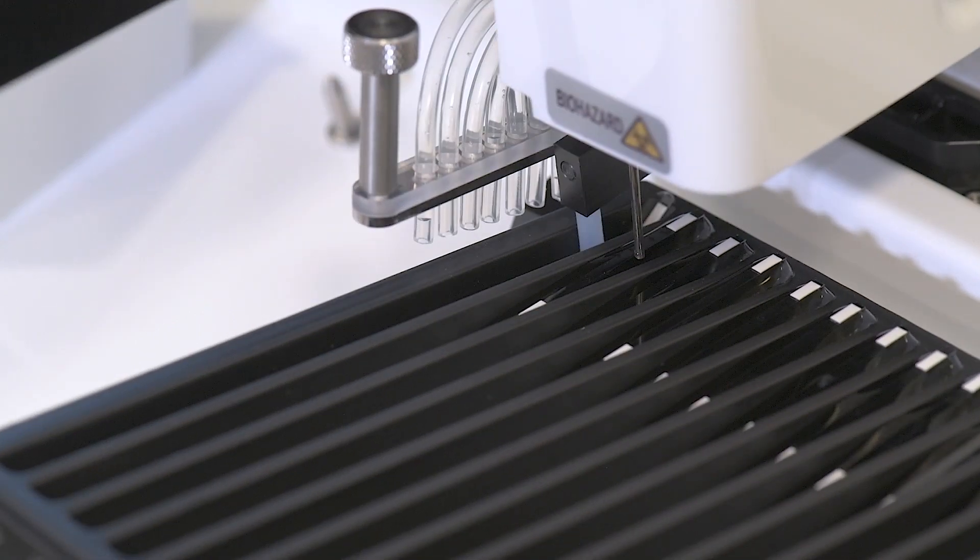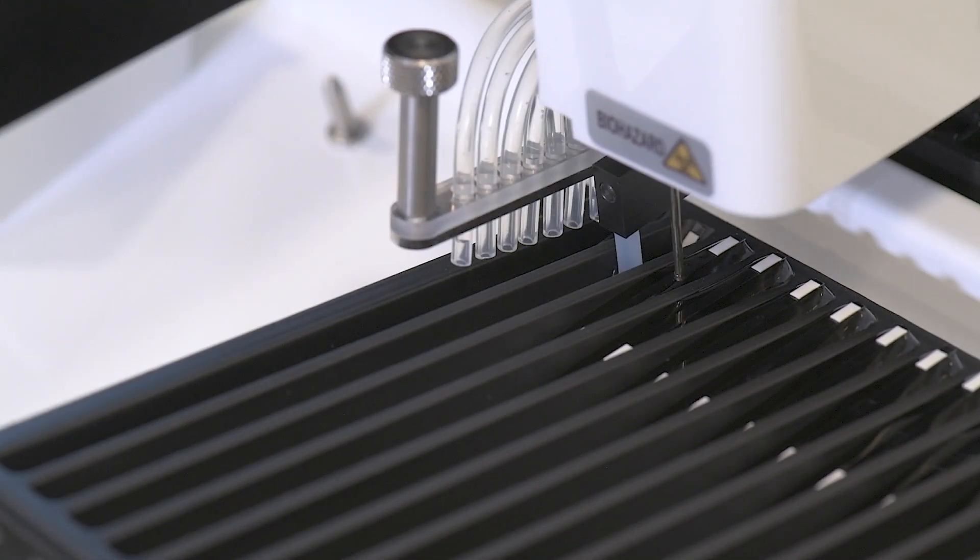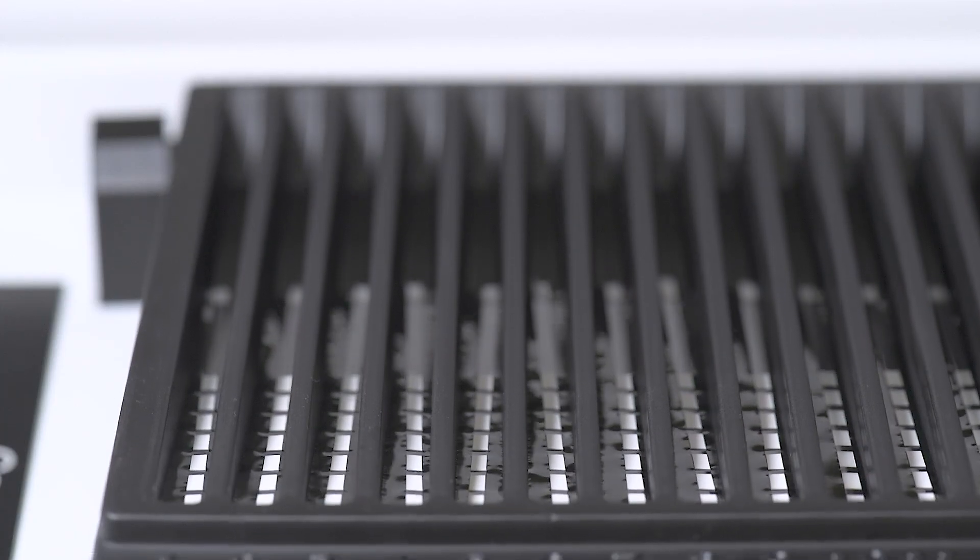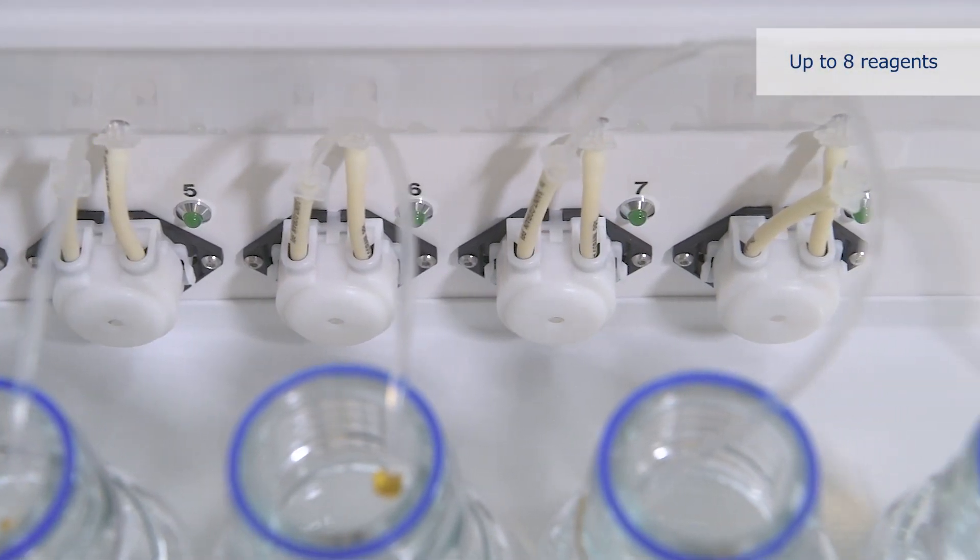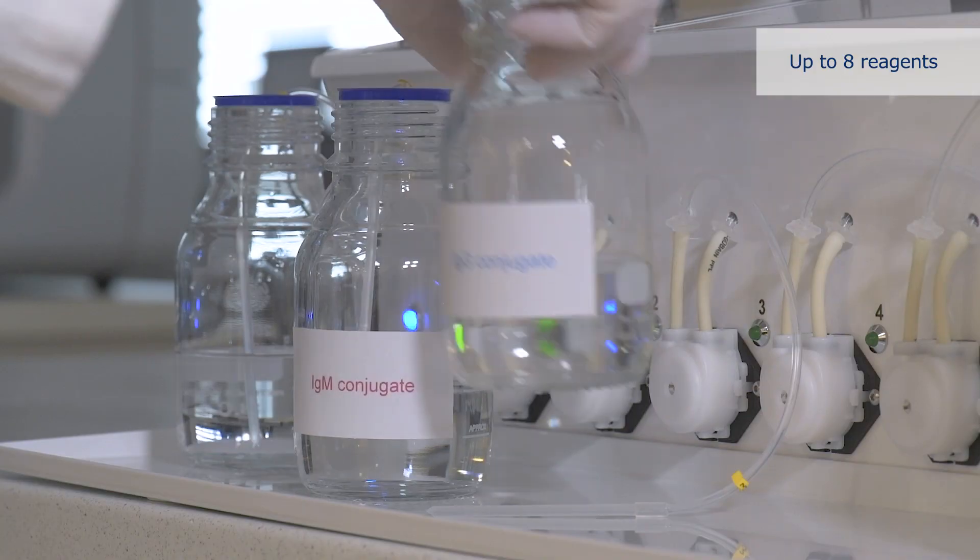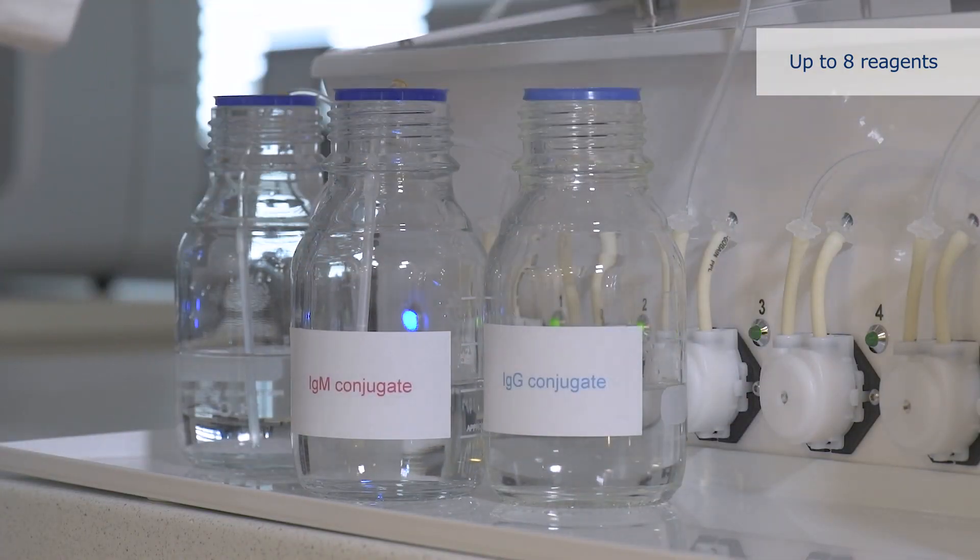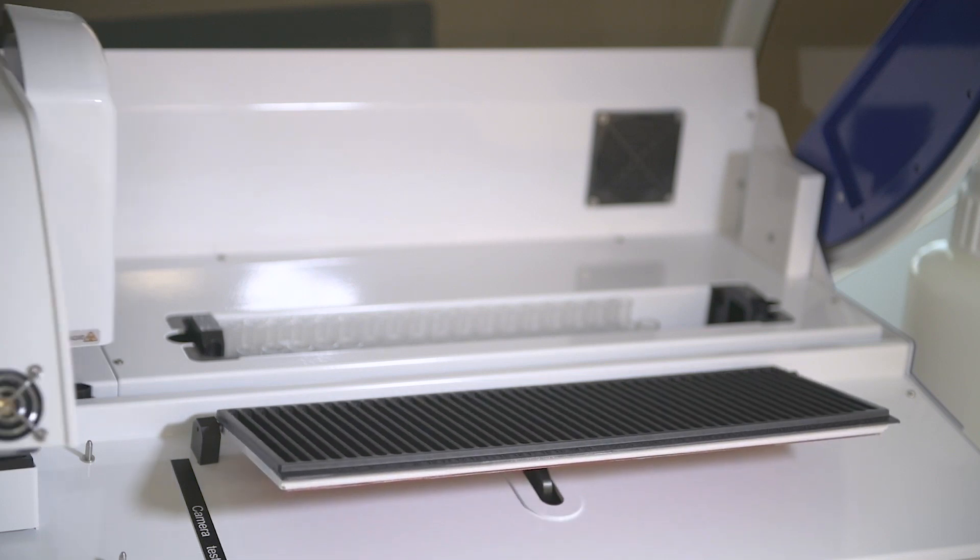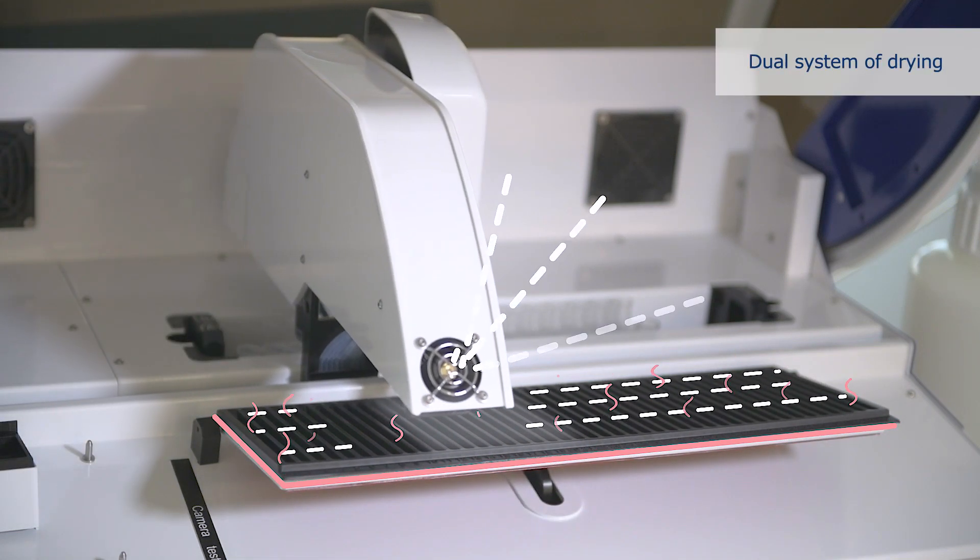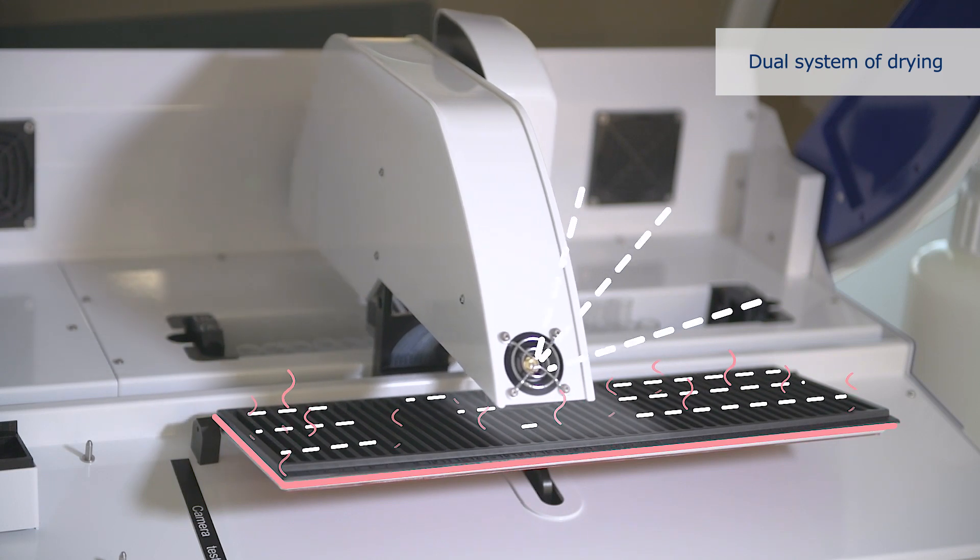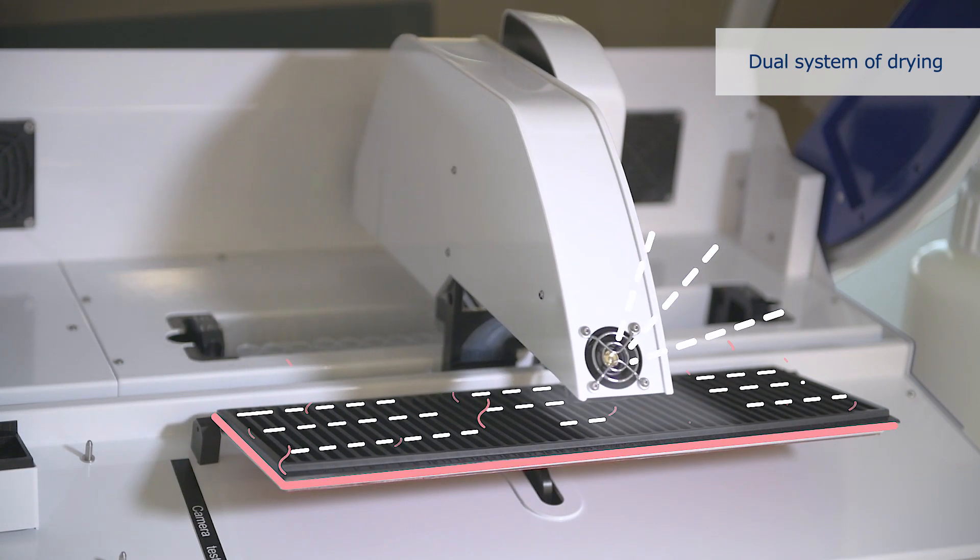DynaBlot Automatic performs all dispensing and washing steps as well as incubating assisted by rocking. Multiple conjugates or other solutions can be combined allowing it to run several types of tests simultaneously. After finishing processing of the strips, the drying time is significantly shortened due to the combination of forced air convection and heating of the tray holder.